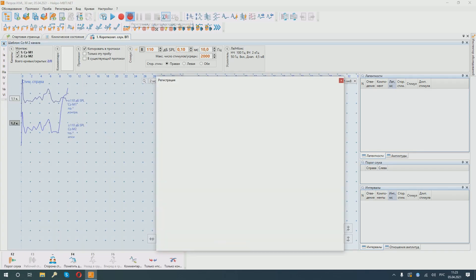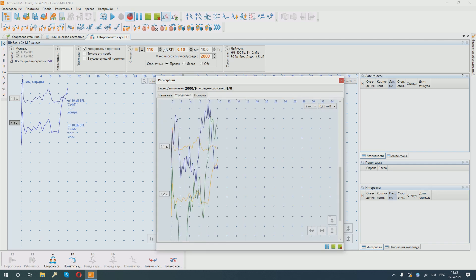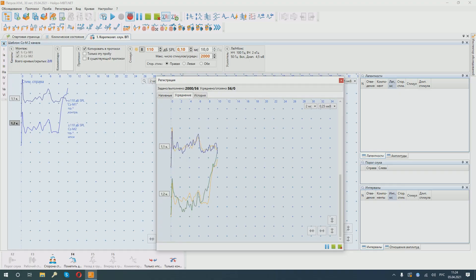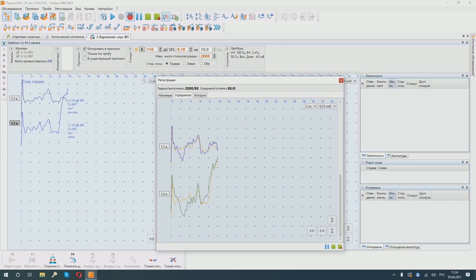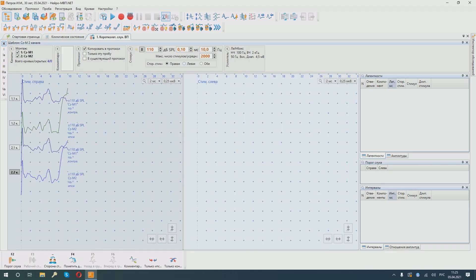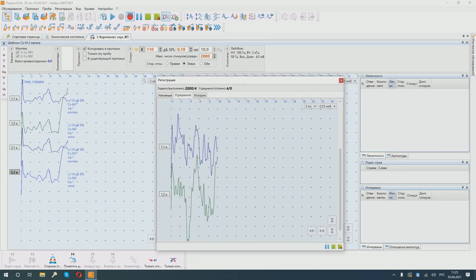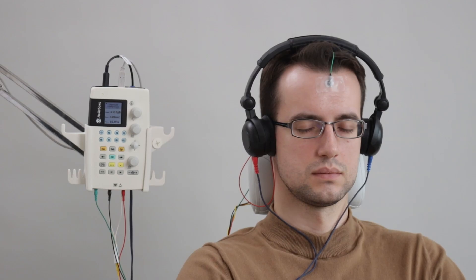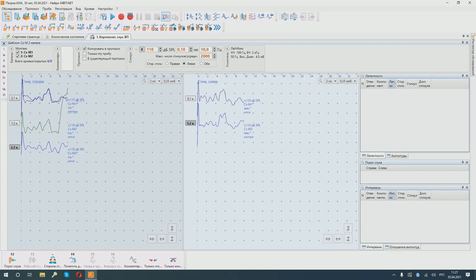Then we start the second cycle of stimulation. We see that the previously obtained curves and new curves in the new stimulation cycle are displayed. We continue stimulation from the opposite side. Having completed the first run on the left side. We start the second stimulation cycle.